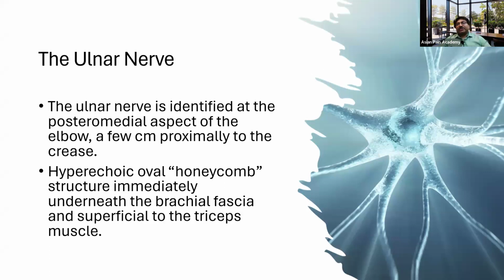Okay. Sorry. We will find it here. Mainly you have to focus in between these two structures. Okay. So we have to get it, but here which is close, muscle or bone at this point?